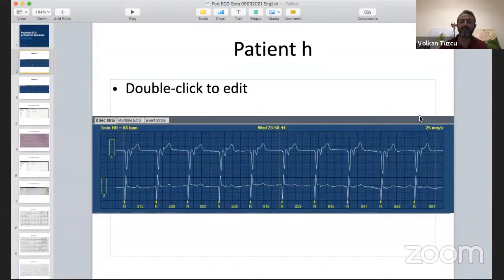Let's say this is the baseline ECG. We do a 12-lead. The 12-lead doesn't help. It will show us a wide QRS, maybe slightly wide QRS. A good suggestion is to make the patient jump around. Excellent. Basically what you're trying to say is, make the atrium faster, right?